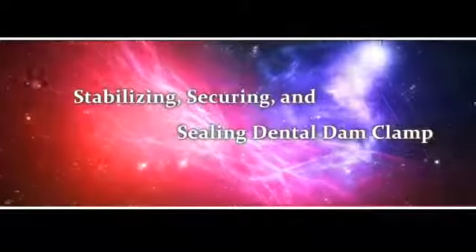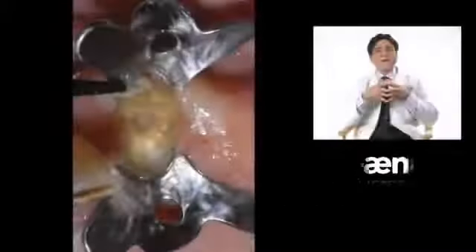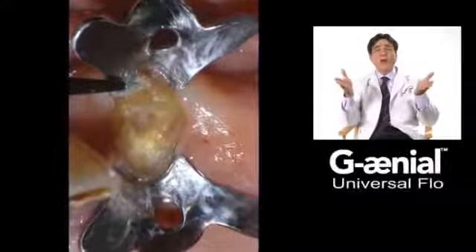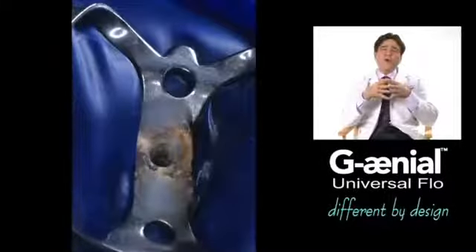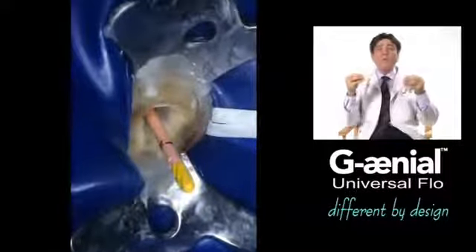Flowables can be used to stabilize, secure, and seal the dental dam clamp prior to procedure. Endodontic and adhesive procedures require proper isolation, and these flowable materials can be used to stabilize, secure, and seal the working field.